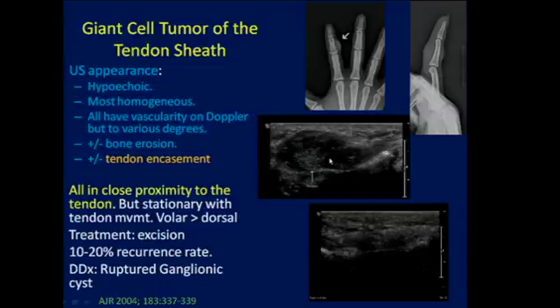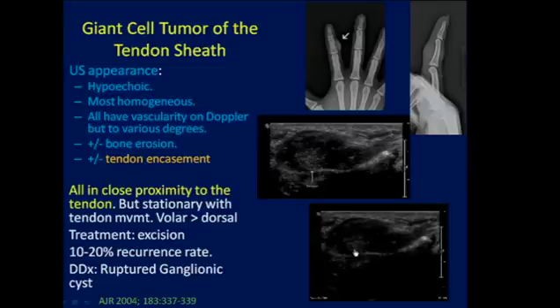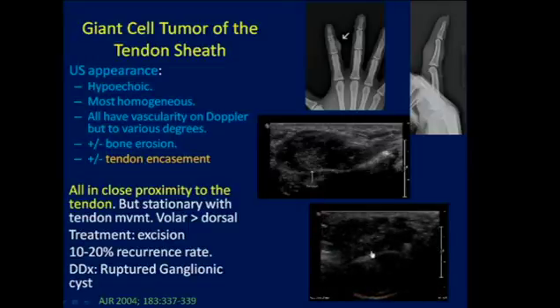On this ultrasound, we see the tendon. We see this hypoechoic mass. And on real-time imaging, note how it encases the tendon. Here's the tendon. We start to see the mass. It's really encasing, coming around this tendon. And this has importance, and this is a reason to scan these entities, to help the surgeon in their resection, since treatment is excision. There is a 10 to 20% recurrence rate.